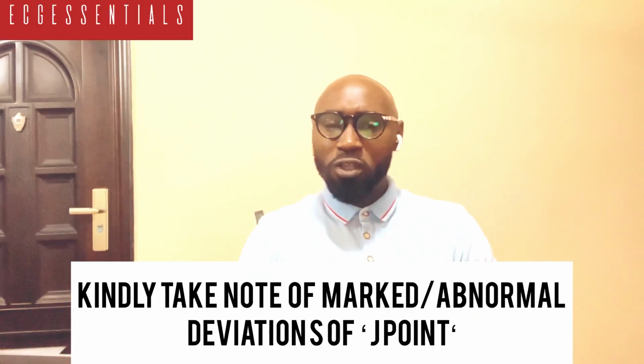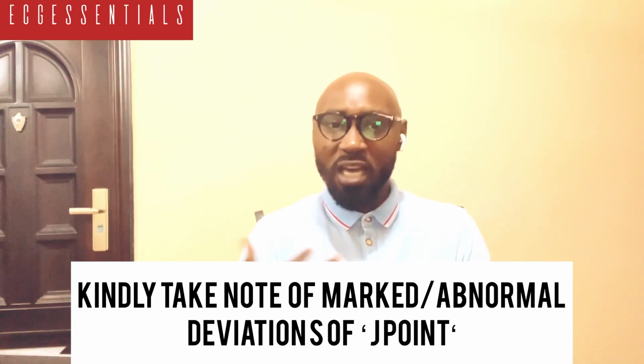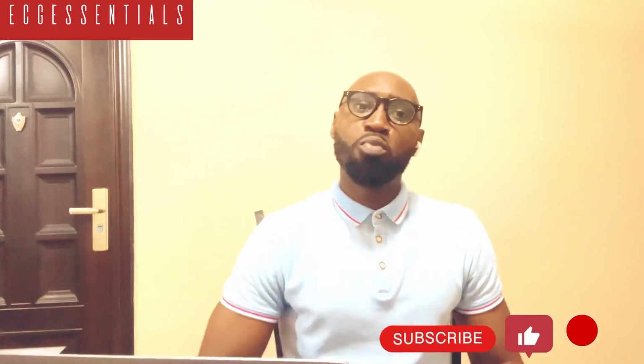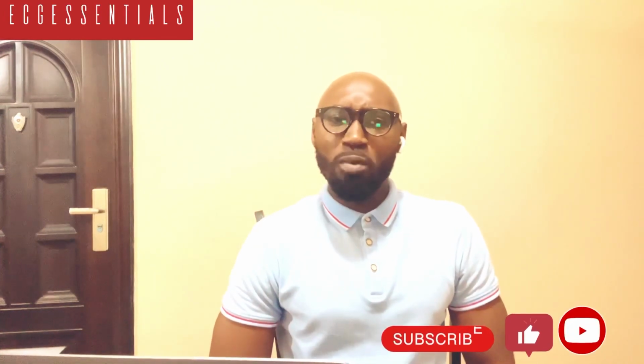In certain conditions, we realize that there may be some deviations from the expected position of the J point. Sometimes it may be benign, it may not point to any significant pathology, but sometimes deviation of these J points may point to more serious events, including various causes of ST segment abnormalities, like even acute myocardial ischemia, even pericarditis. So it may be important to pay attention to the position of the J points, and if there are any deviations, try to interpret it in context.